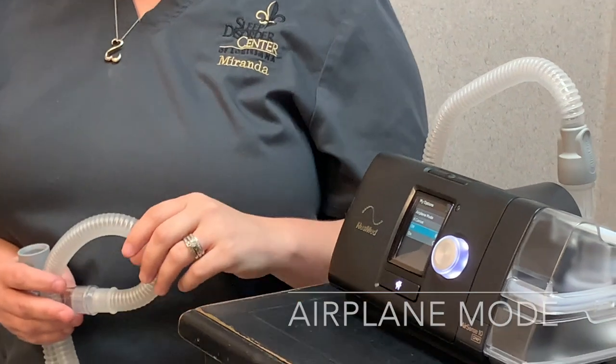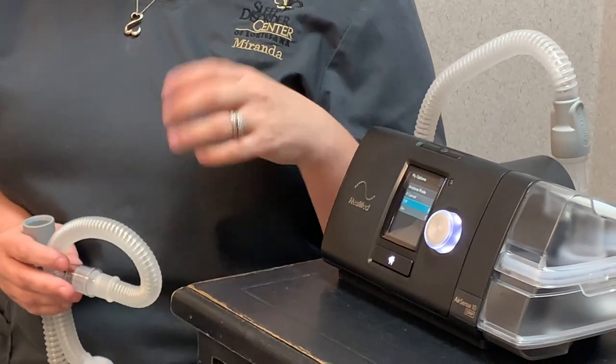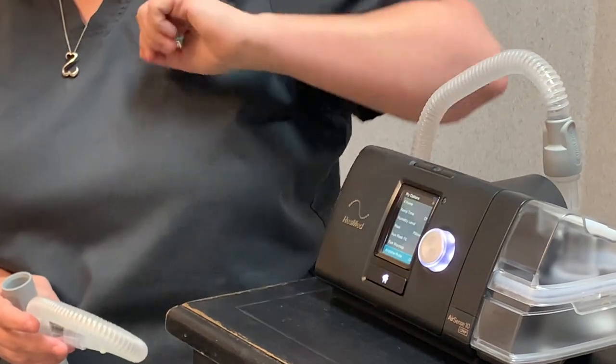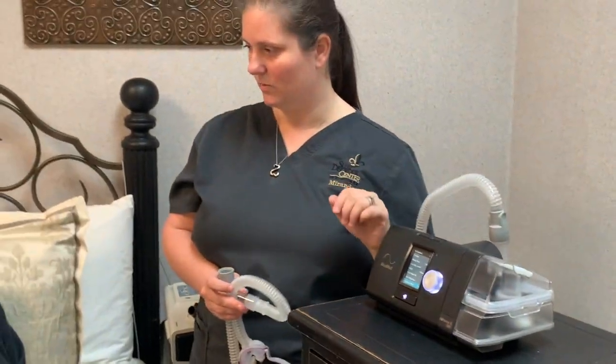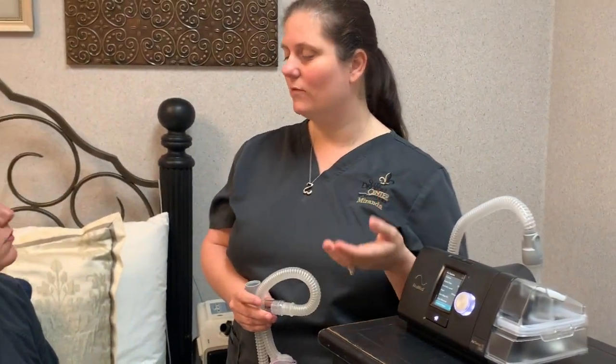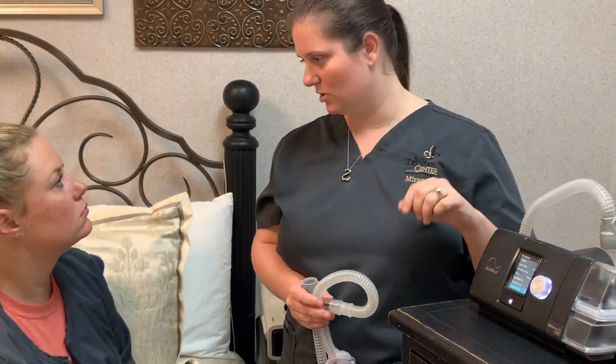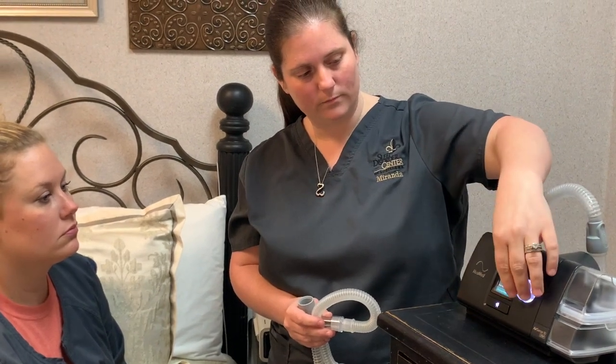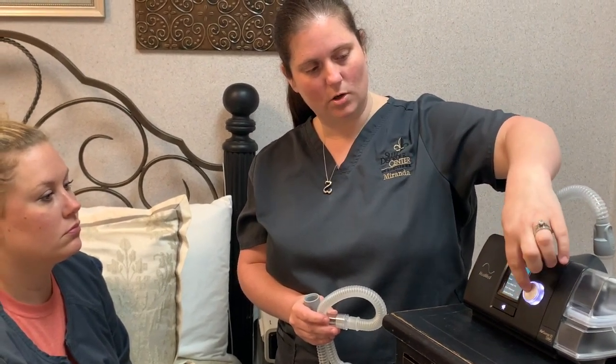The last menu item is airplane mode. Do you have little kids at home? Yes? They can get into this menu and play — they can't really hurt anything, but they can turn airplane mode on, which would block out the cellular wireless modem inside the unit. If you see the little airplane icon in the corner, just turn that off, otherwise we can't send or receive any data from you. Then just go back to your home button.